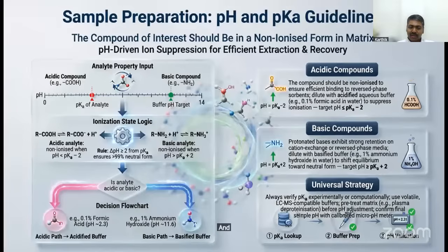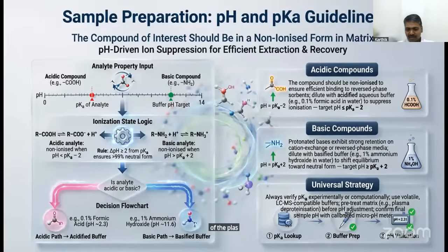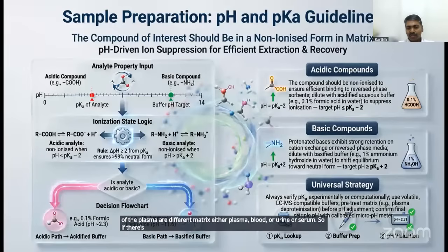And coming to the sample preparation. There are three different techniques that we generally use for extraction of samples from plasma or different matrices, either plasma, blood, urine, or serum. The first one is the protein precipitation technique.